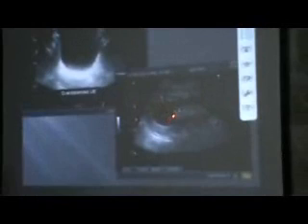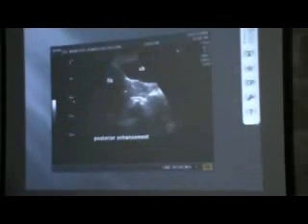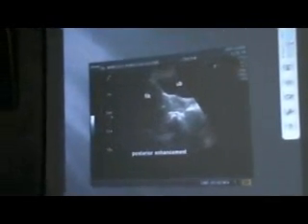Likewise, as you can see here, this is the kidney. There is a cystic area inside. You can see the posterior wall of the kidney here, where the soft tissue is, and this is the cystic area, so its posterior wall is brighter. So if we are in doubt whether a substance within the liver or other organs is cystic or solid, we can look at its posterior wall. If the posterior wall is brighter, there is posterior enhancement, that is, a cystic structure.